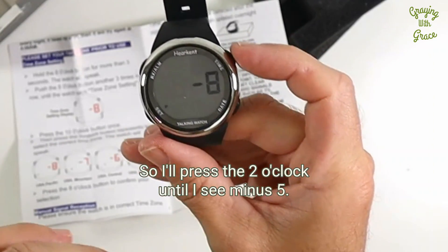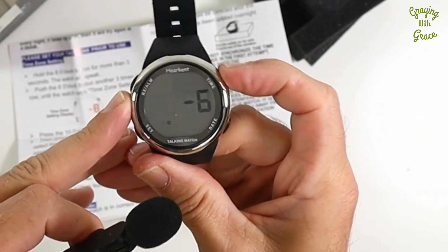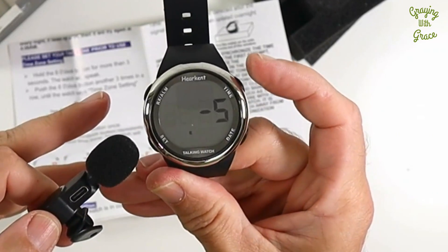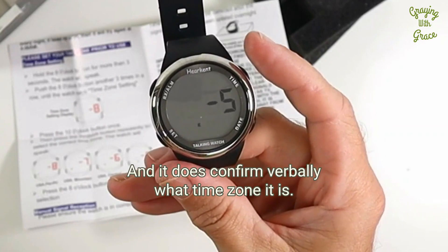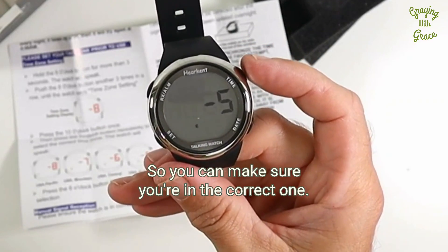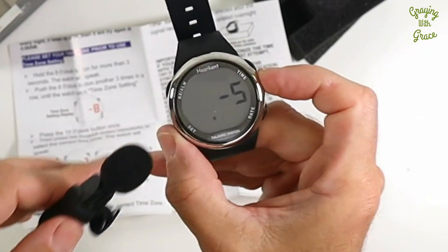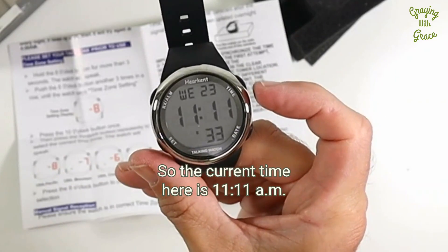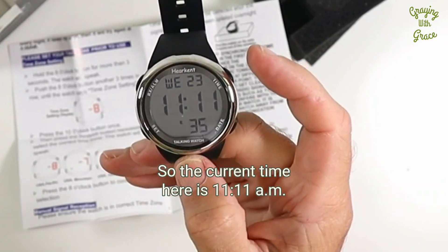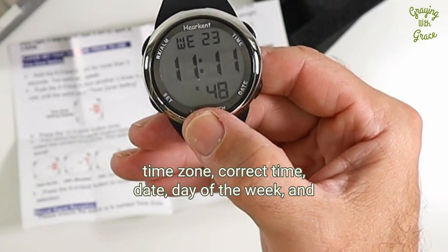I'll press the two o'clock until I see minus five. The watch cycles through: 'USA Mountain. USA Central. USA Eastern.' It confirms verbally what time zone it is, so you can make sure you're in the correct one. Then I press the eight o'clock button to confirm it. The watch says: 'Confirm. 11. 11 a.m.' So the current time is 11 a.m. in the Eastern time zone, shown by the little 'E' on the display.